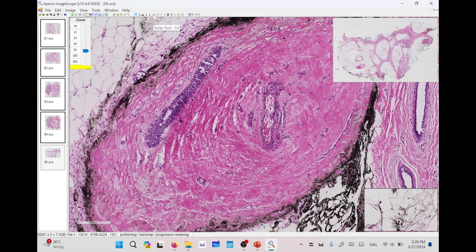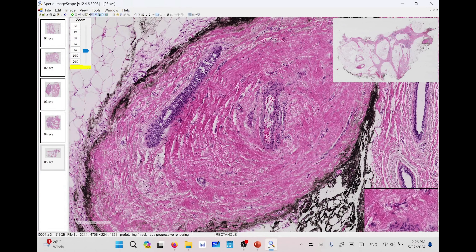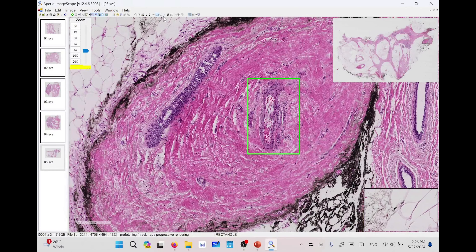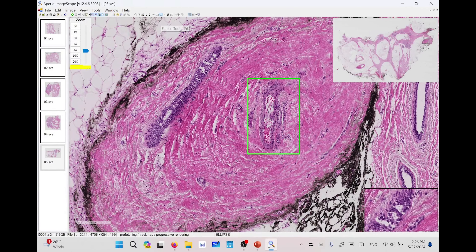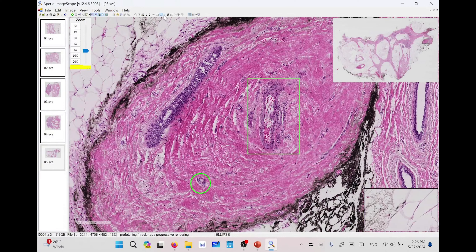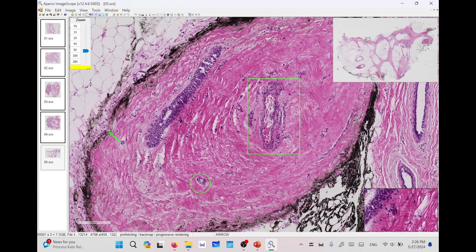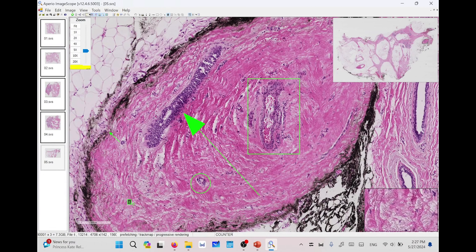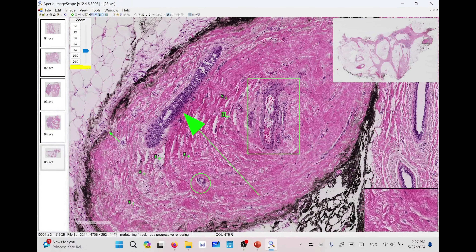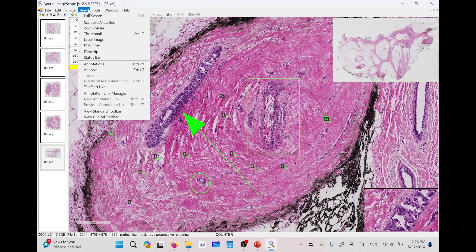ImageScope provides simple annotation tools as seen in the toolbar. It starts with the rectangle tool — you can also press F5 to draw a rectangle. You can draw a circle, ellipse, or oval. You can also draw an arrow by pressing F7, and the more you stretch the arrow the bigger size it will show. You can also use a counter tool to count tissues or nuclei — simply by pressing on any point you can start counting.